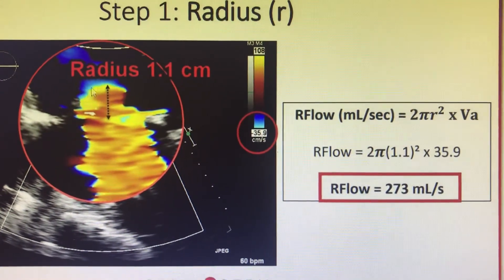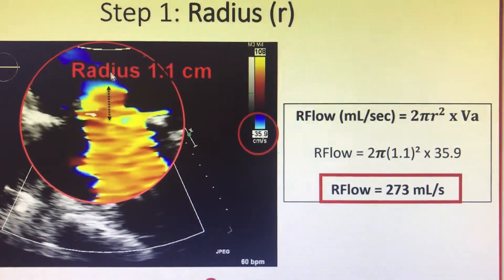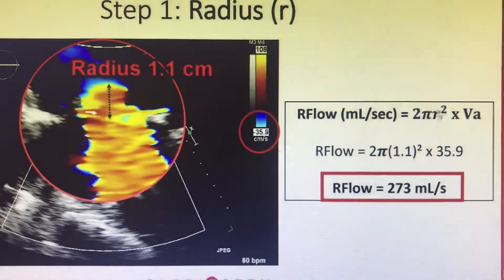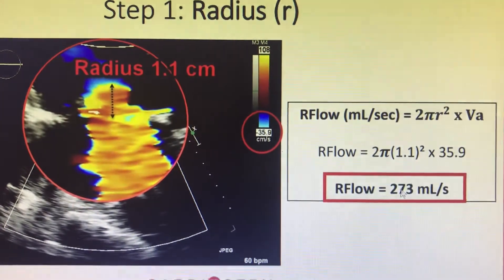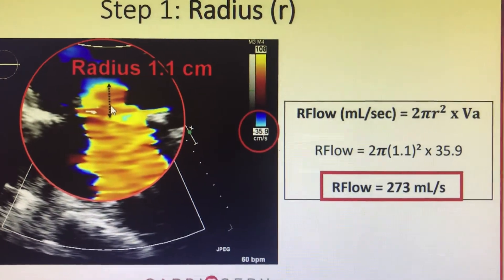If it is less than hemisphere, if it becomes more bulging like oval, most probably your r will increase and the regurgitation flow will increase. It will overestimate the regurgitation.